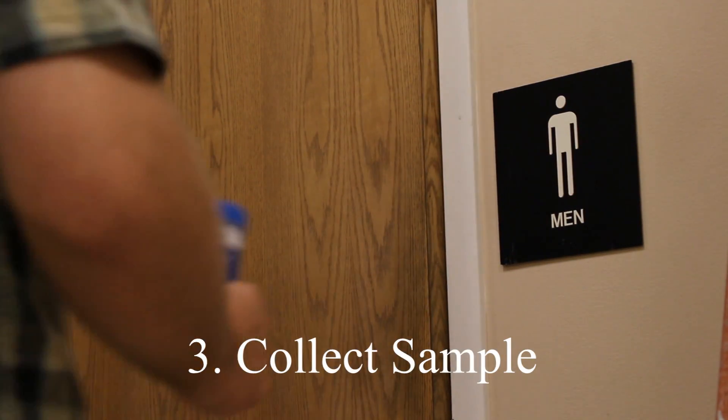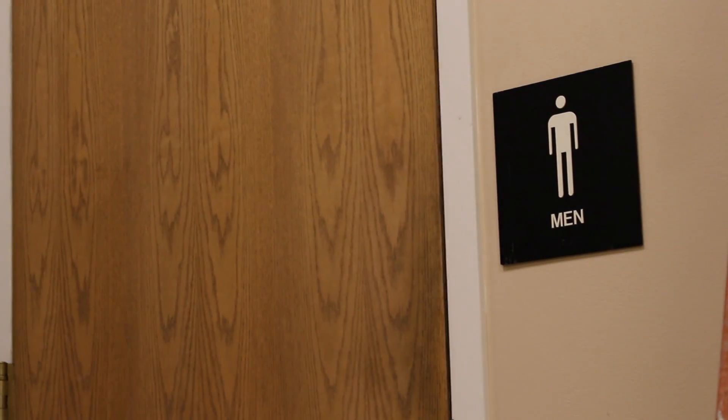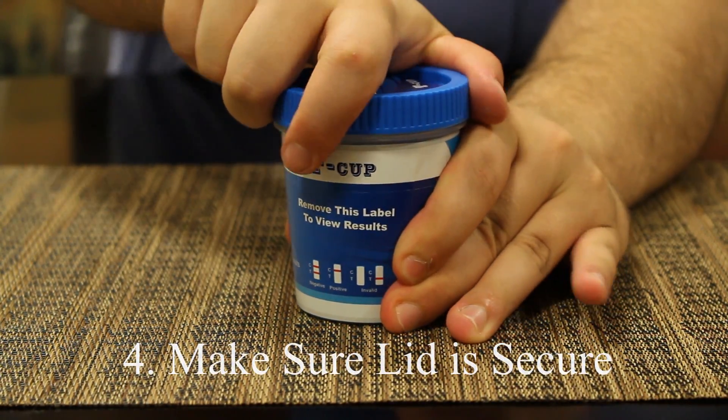Step three: collect the sample. Step four: make sure the lid is secure.